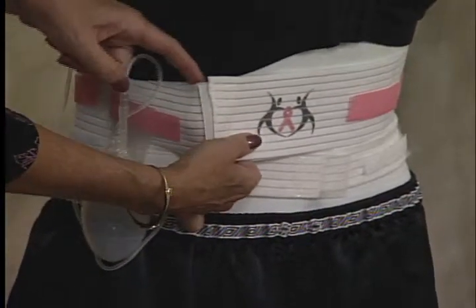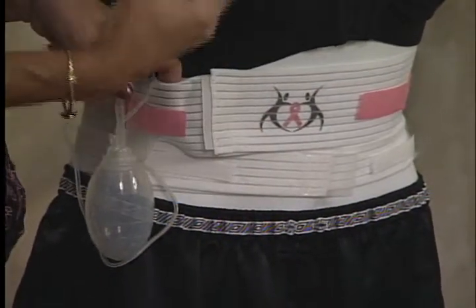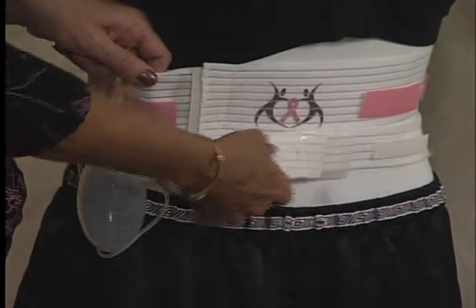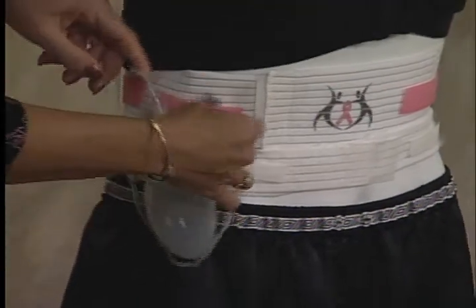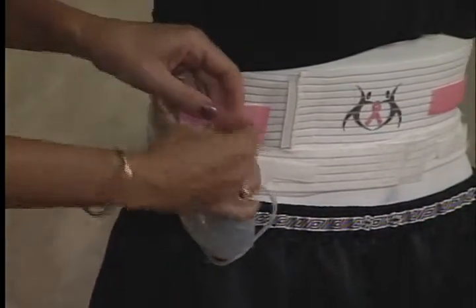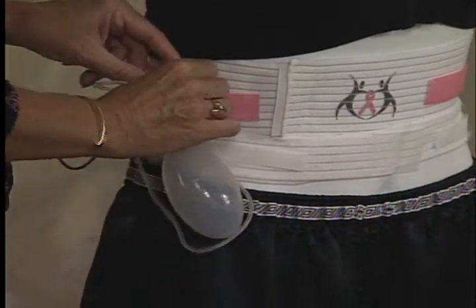The first band is to be worn with the bra when you're dressed and out and about. The second band is to be worn in the shower so that you have something to hold your drains and be able to just leave it to dry with your towel until the next time you shower. The Velcro on the side actually comes loose and runs through the top of the drain here, basically acting the same way as it did before on a belt loop.